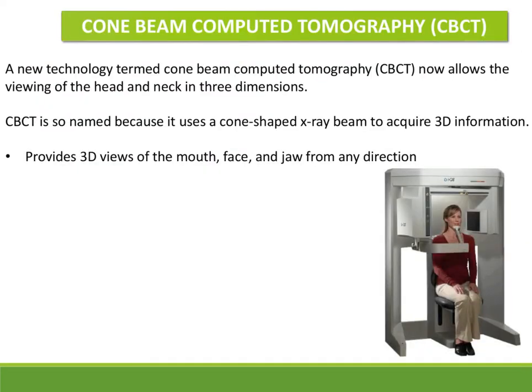So the next topic is cone beam CT, which is actually for your next week, but we are completing this because you are going to do your practical clinical rotation. So you have to know the basics about the cone beam CT.